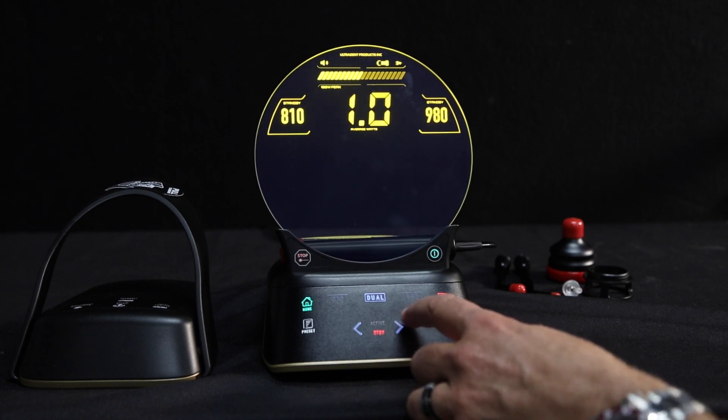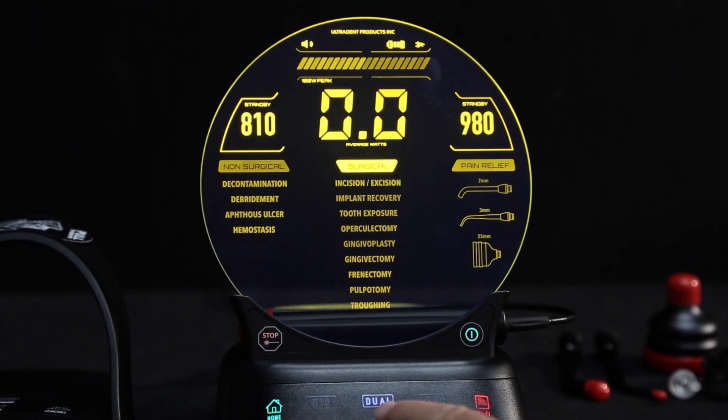The Gemini Evo comes with presets organized into three intuitive categories: non-surgical, surgical, and pain relief or PBM.